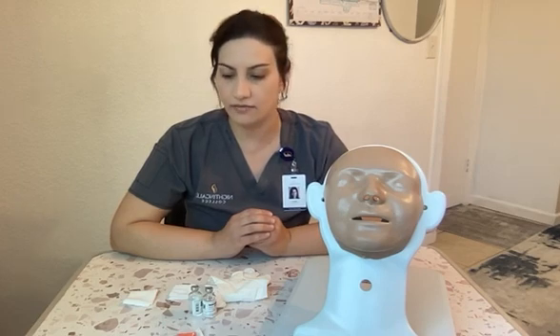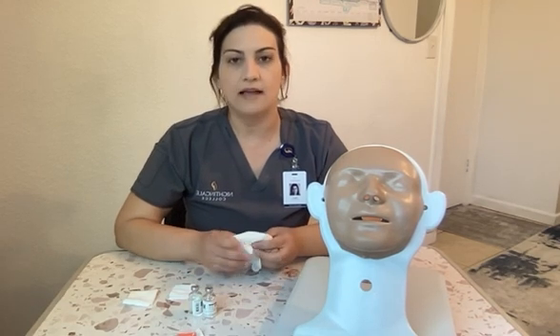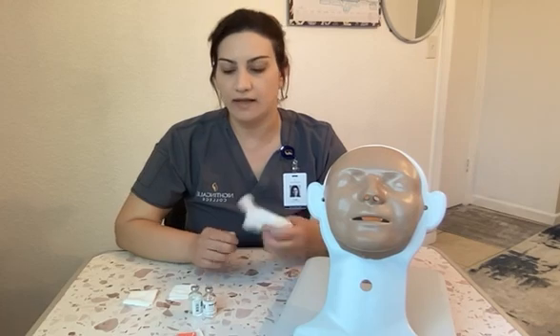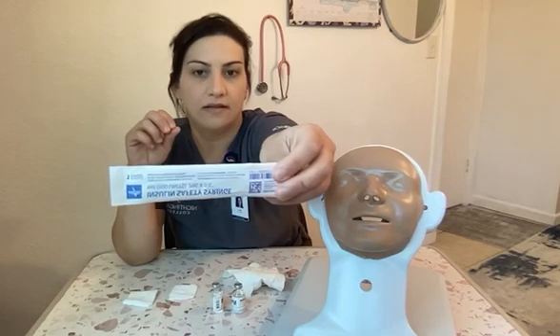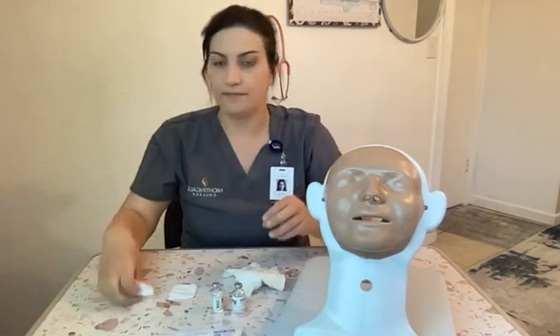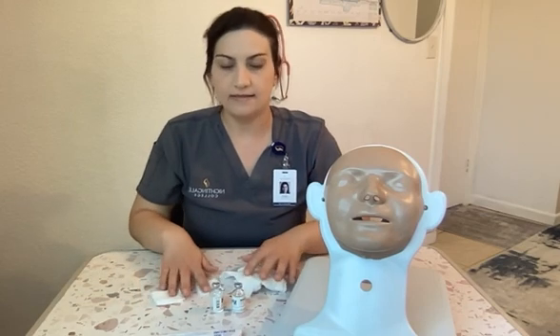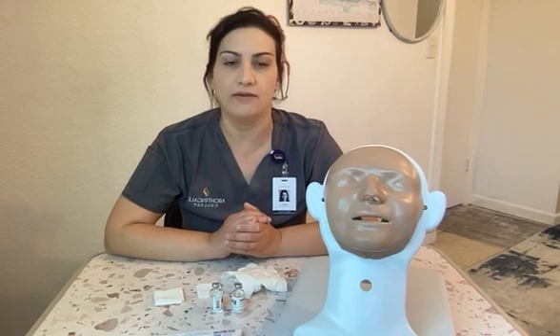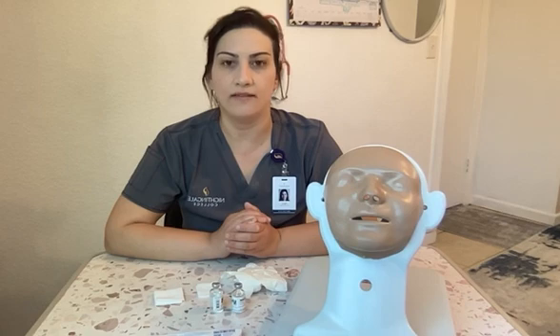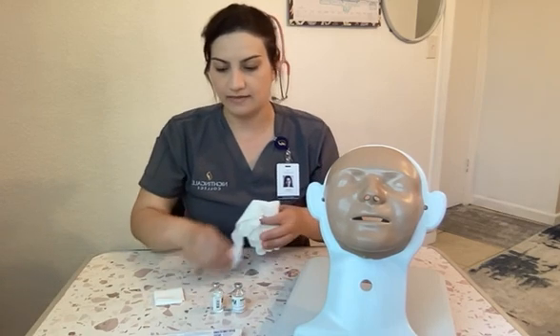Next, we want to go ahead and talk about the supplies. So we need a pair of gloves, medication vials, syringe and needle. We're going to be using this one, the insulin needle, 2 alcohol wipes, and gauze pad. As I said before, the patient is going to be receiving 4 units of regular, 8 units of NPH, equalizing 12 units of insulin. Next, I'm going to go ahead and gather my supplies here.